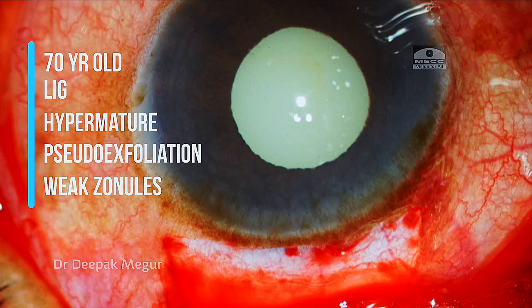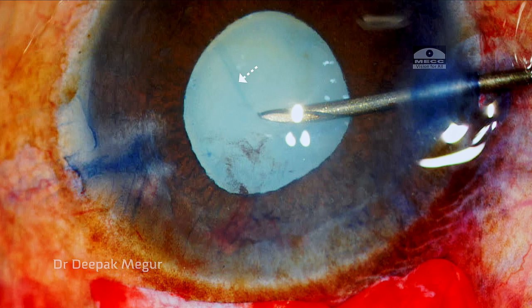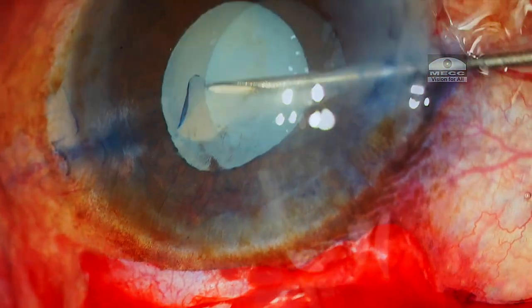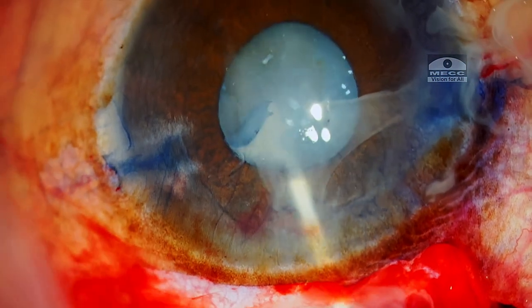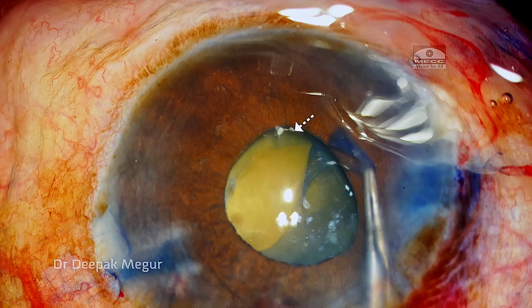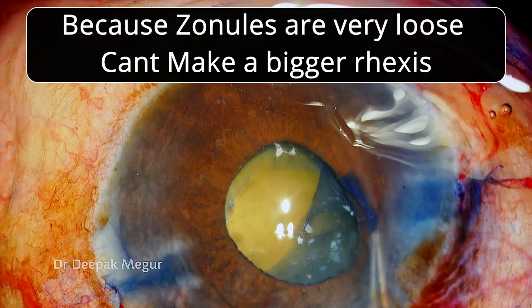Another challenging case: small pupil, pseudo exfoliation, loose bag. I thought I could make a bigger rhexis in this eye but I underestimated the zonular weakness. As I'm performing the rhexis, I realize it's extremely difficult to tear and make a bigger rhexis simply because of the extremely loose zonules.